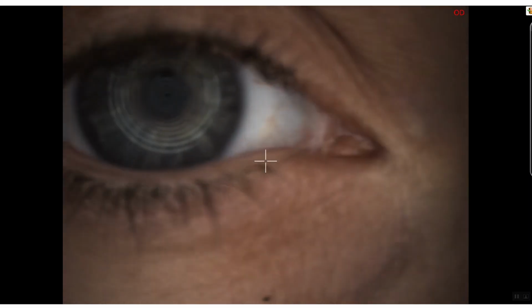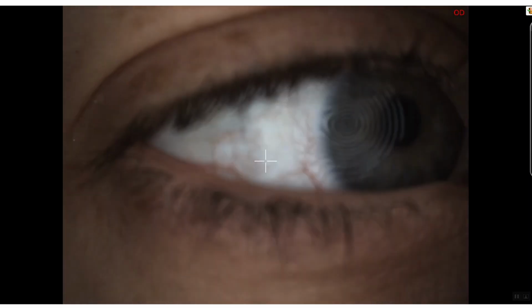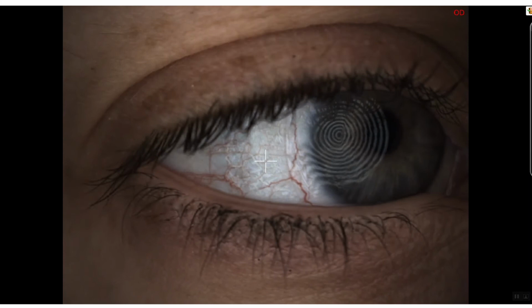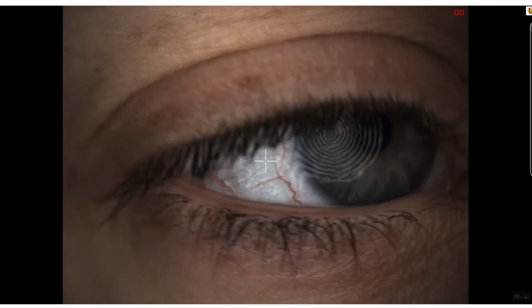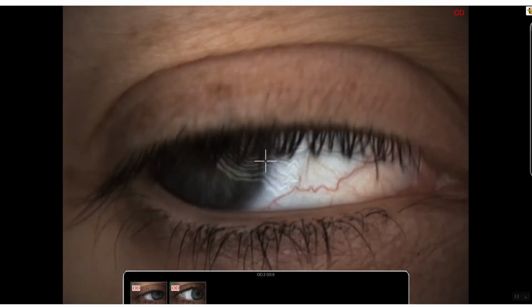And we'll do an image of the patient. Look straight in front of you and look slightly to the left. Okay. Left, left, left. Okay, and then we just have to focus the image and click the button. I like to take an image. Look to the right, please.